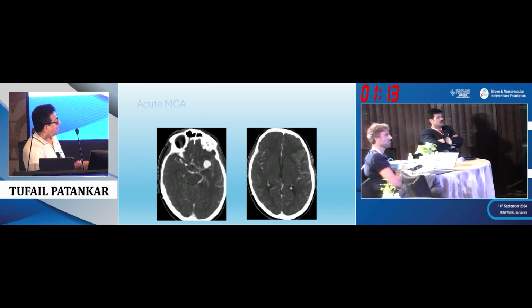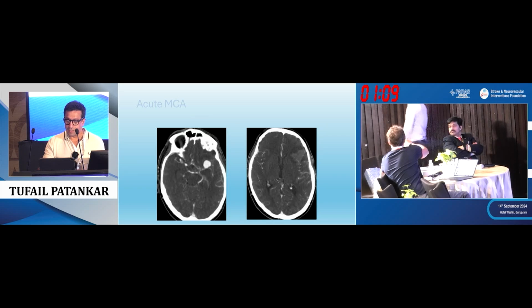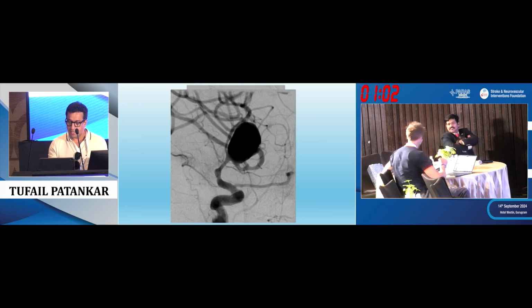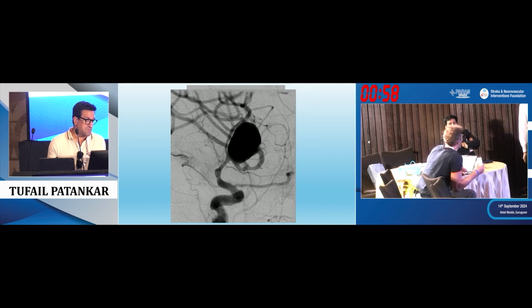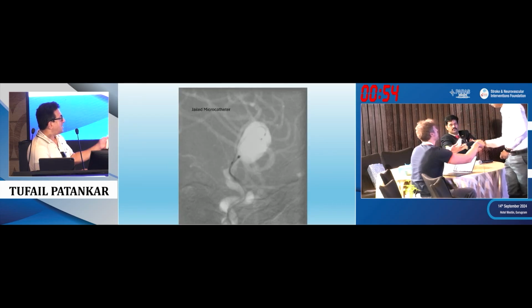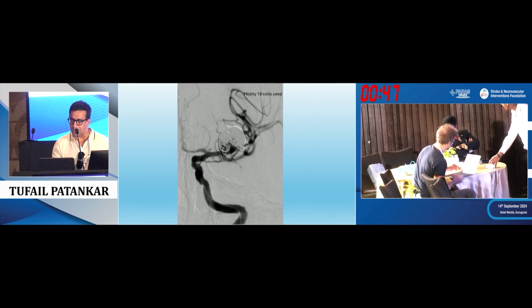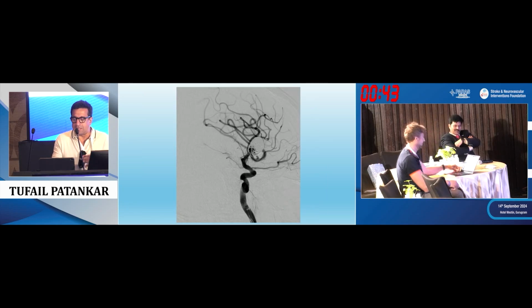Here is a large hematoma, big aneurysm. Surgeons would love to clip this, and we can put an endovascular clip, as I'll show you in a minute, where you can see the large aneurysm. I usually show this in neurosurgical conferences because that upsets a lot of people, but in a nice way. But you can see I've got a jail and I've got a web, and you can put a web here and then you can coil the aneurysm. So you can innovate with the technique.